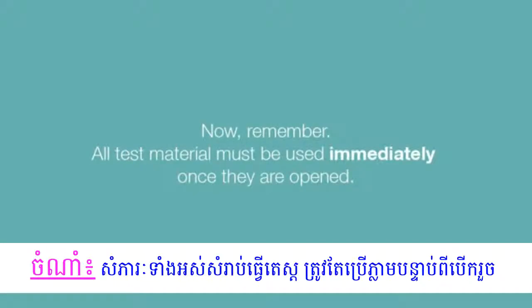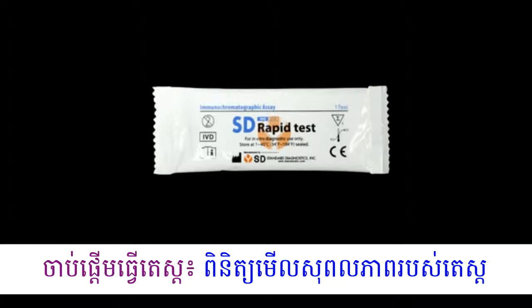Now remember, all test materials must be used immediately once opened. Let's begin the test.